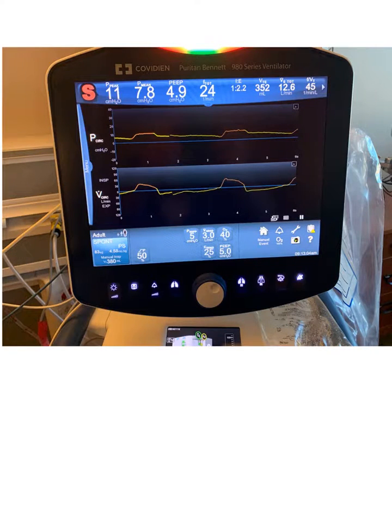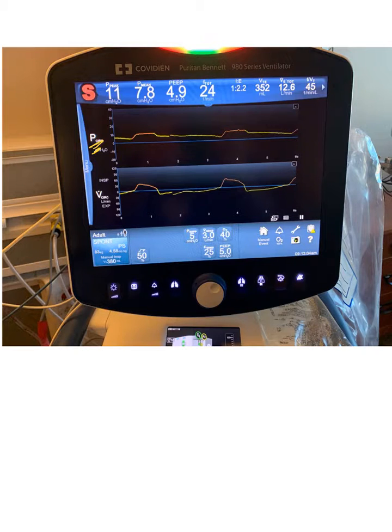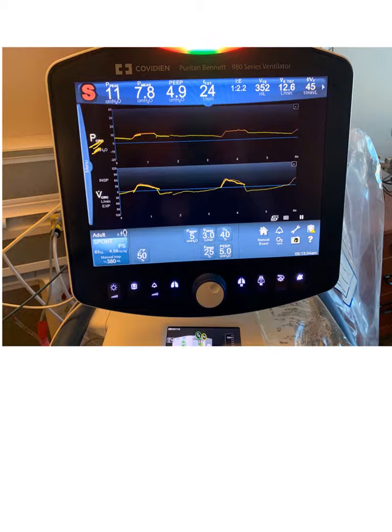Now let's demonstrate pressure target. Look at the pressure waveform — every breath the pressure goes to the same level and comes down, same level and comes down. Look at the flow: it's kind of going down like a decelerating ramp, but it's not constant — it can be variable. You can simply say this is a pressure target because the ventilator is keeping the pressure constant throughout the cycle.